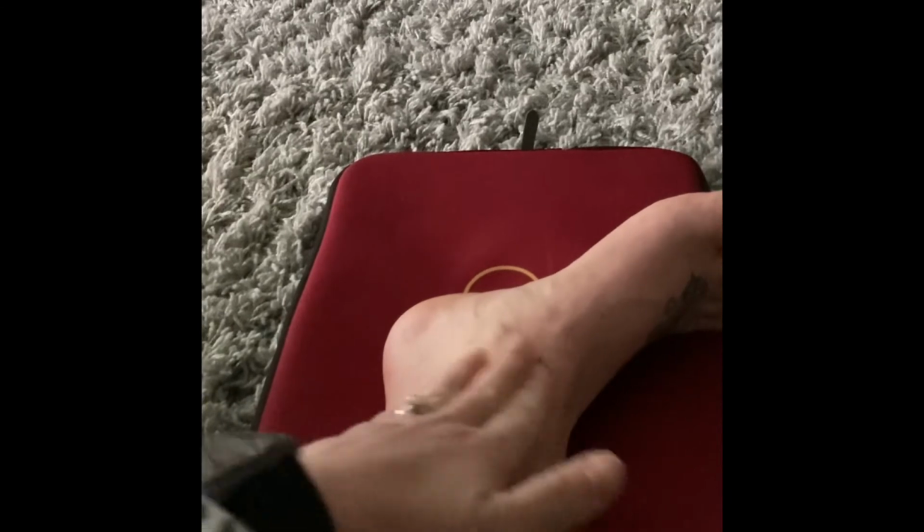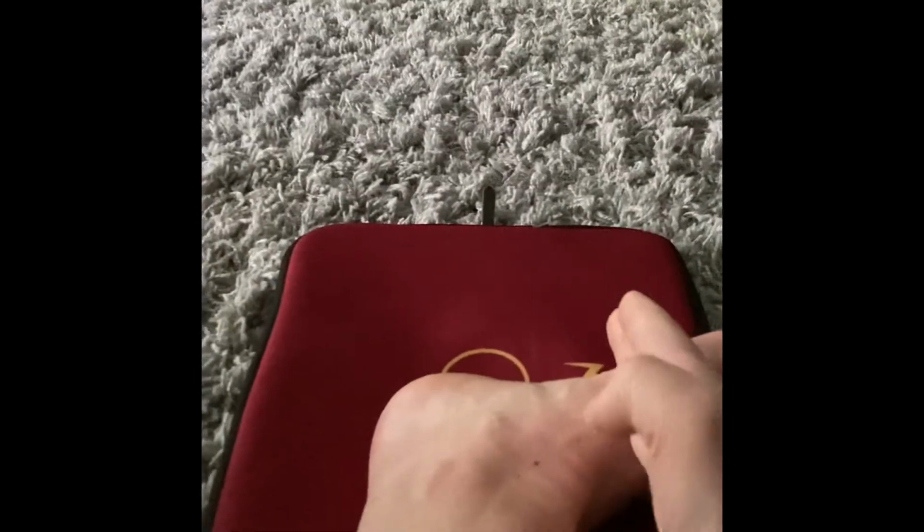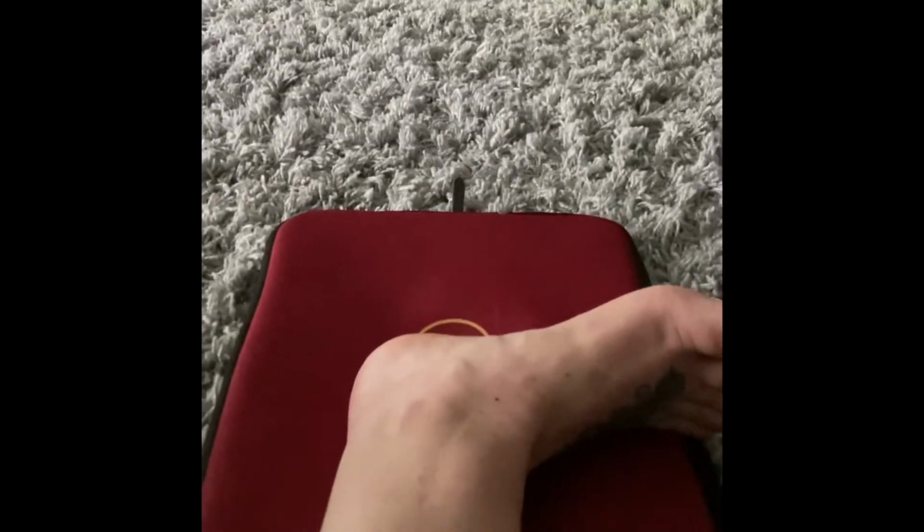So right about in this area here through the center of the film, and we should be able to see the distal tibia and fibula, the ankle joint, the talus, the calcaneus, and the base of the fifth metatarsal. So we don't really necessarily need the toes in this view.